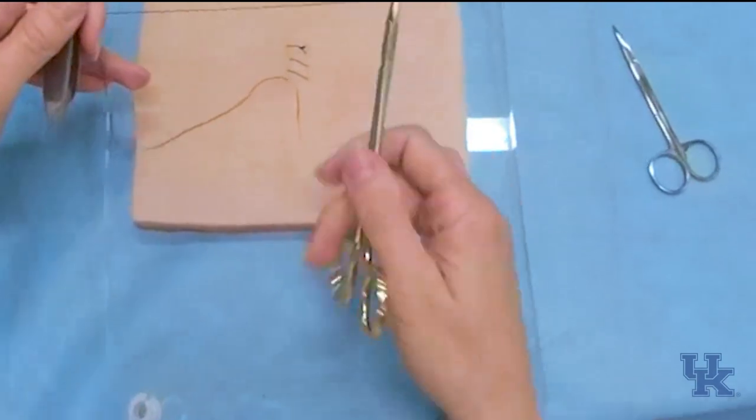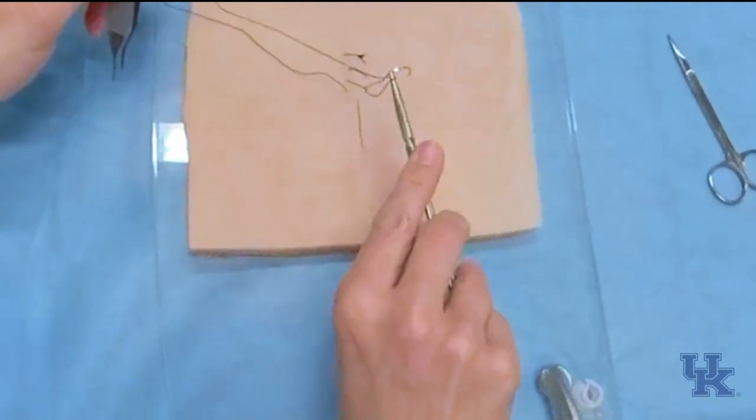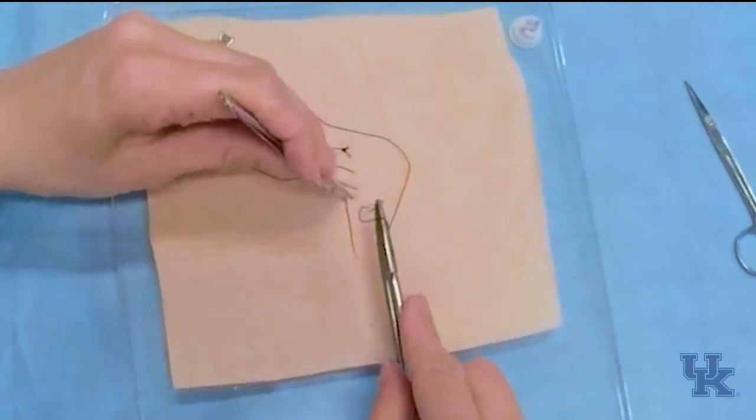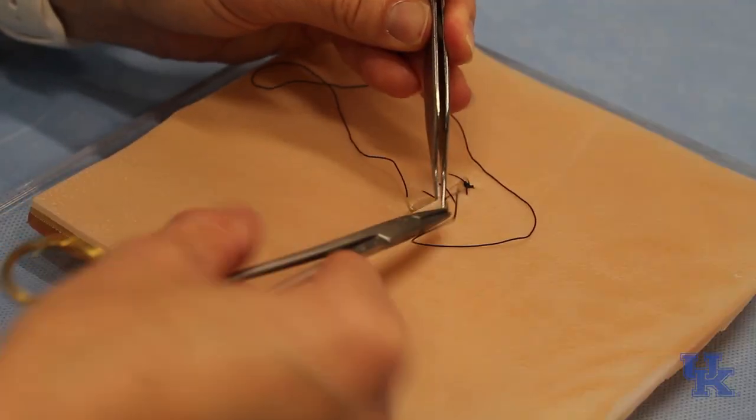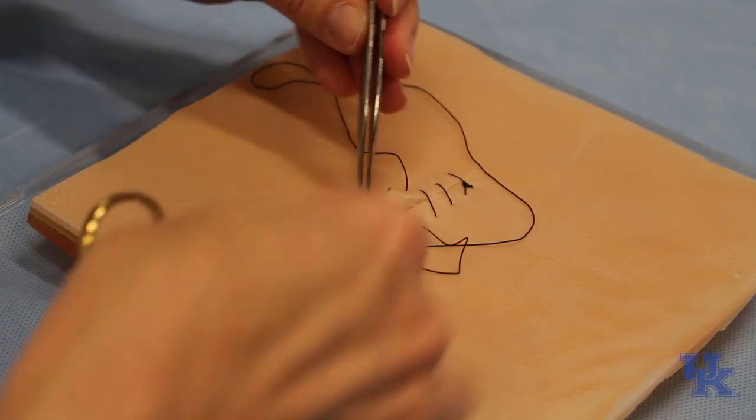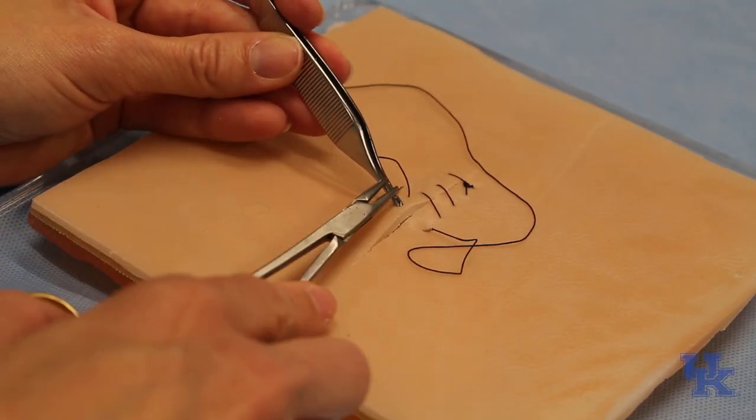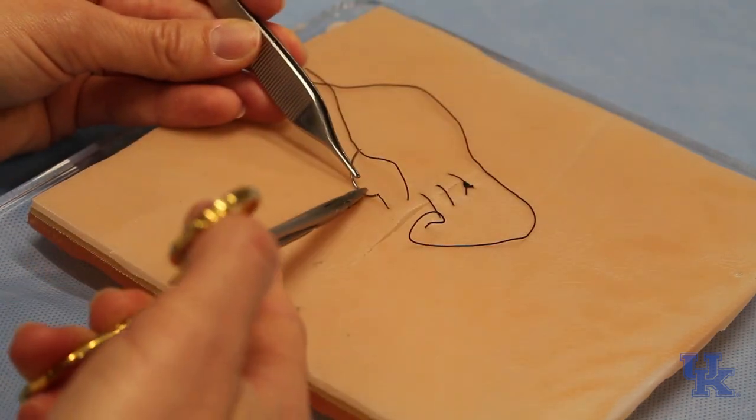So sometimes we'll re-grab the instrument a different way. Palmed is what we call it, which is when we do this to throw a stitch. It's a little bit easier to get that 90 degrees that we want in that manner, but then you need to rotate back to hold it in the correct way.